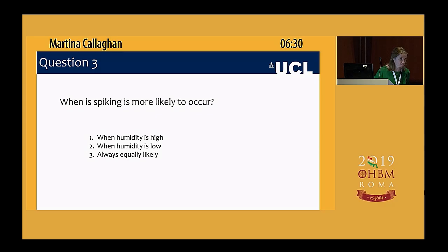And third is, this is fantastic from your DQ, it's really great. For a daily QA, is there anything you do? Do you do the standard scanner coil check when your technologists or your users warm up? Or do you do something like a 5 to 10 minute QA every day? No, we don't do it on a daily basis. So once a week on all systems and all coils to make sure that everything is okay. We do warm up every day to make sure that the scanner is in a stable state before anybody starts scanning. And then we do the online QA, which is going to be variable, right, because it's not quantitative in that sense, but it's the online QA with the individual in the magnet. And is your warm up just a couple of EPI runs? Yes, exactly.